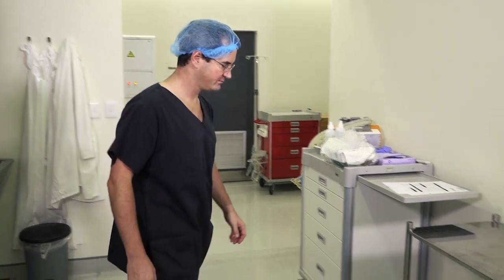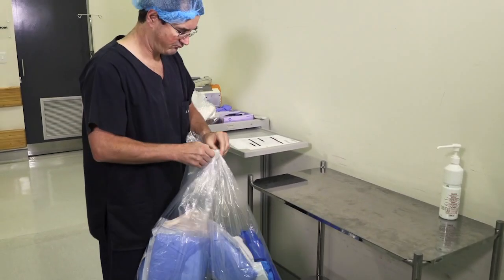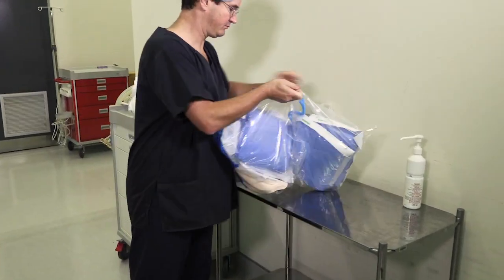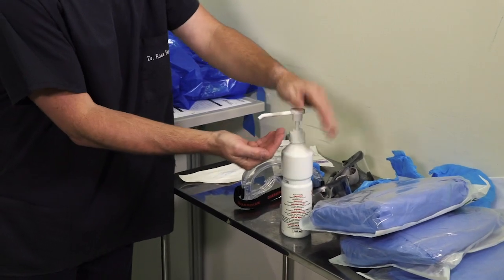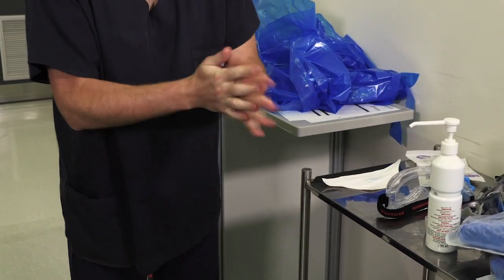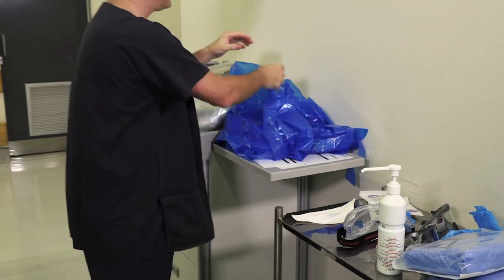Okay, Ross, can you open up the PPE bag, put it out on the table and don your PPE. Ross, can you start with some hand hygiene?